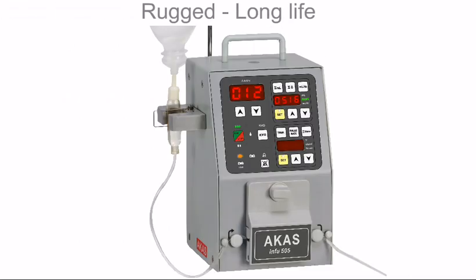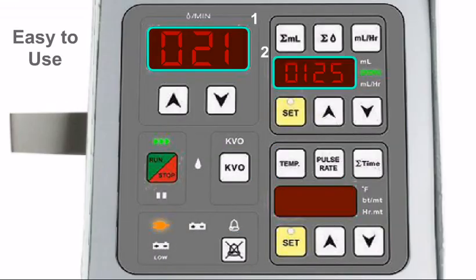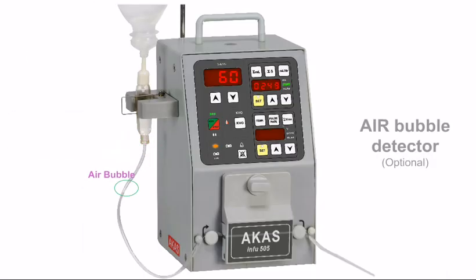AKAS Infu 505 is a rugged, sturdy product for long life. 17 keys, 3 large displays, and multiple LED indicators make it the most user-friendly infusion pump you can ever come across. With a host of features, an optional air bubble detector avoids air embolism.